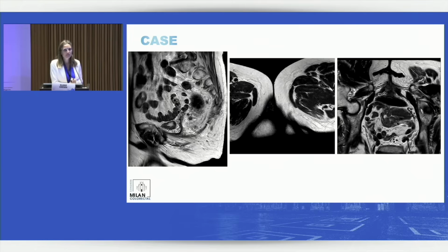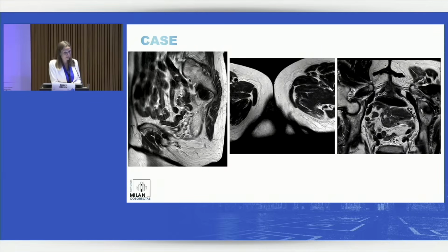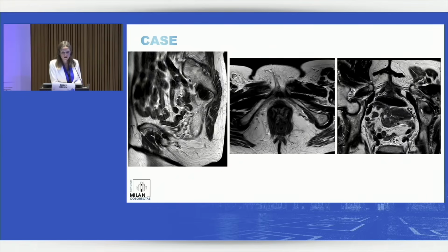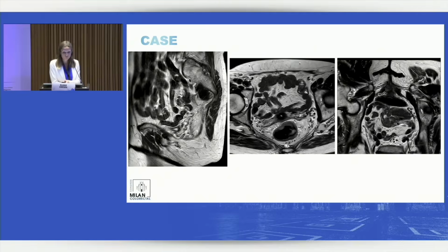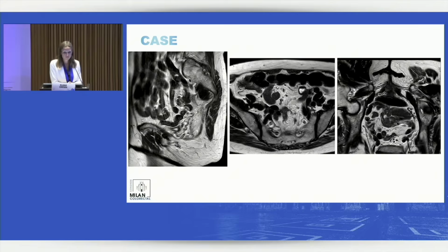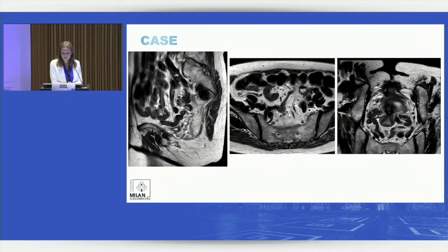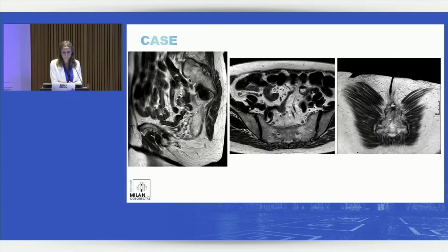Have a careful look, because I can only start the video and not pause it. So this is a distally located tumor near the anorectal junction with invasion into the mesorectal fat, which you can see here, also invasion in the vessels, a lot of lymph nodes, I think tumor deposits, so this is quite an ugly tumor.